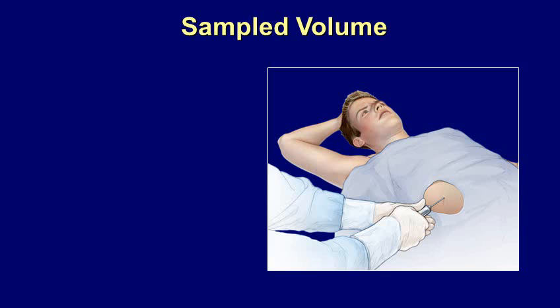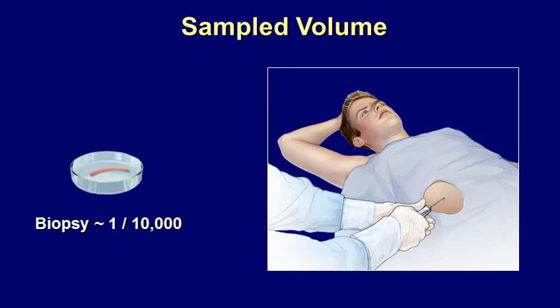How can we understand these results? Well, let's start with liver biopsy and its limitations. Liver biopsy assesses the condition of the liver using a tiny specimen that's only about 1/10,000th of the volume of the liver. This has obvious potential for sampling error since fibrosis is often quite heterogeneous in the liver.